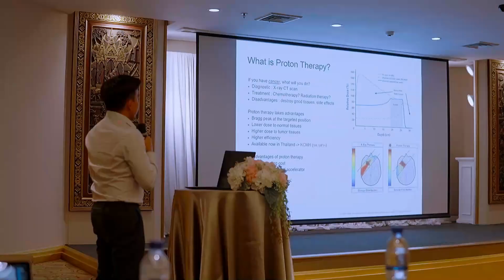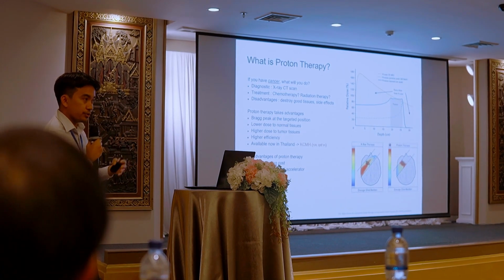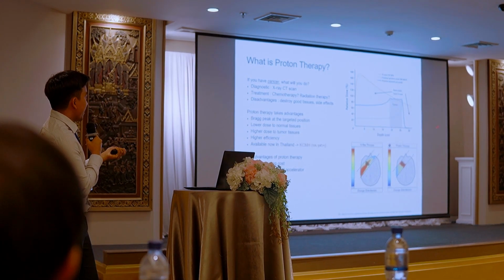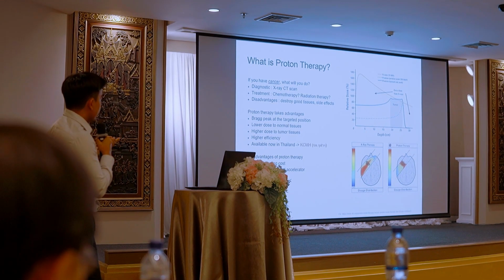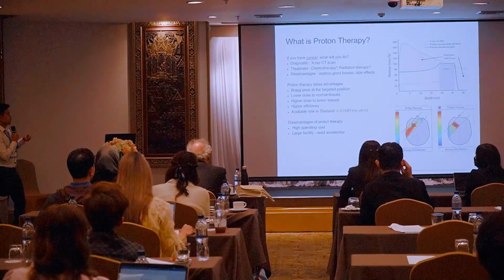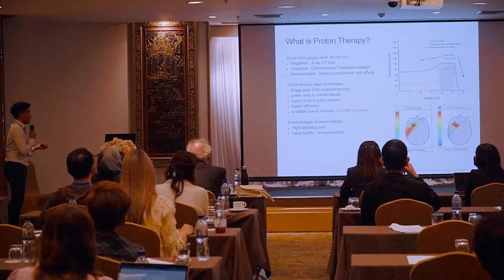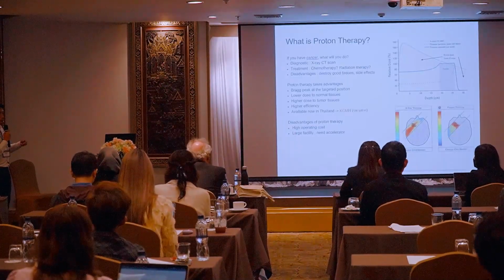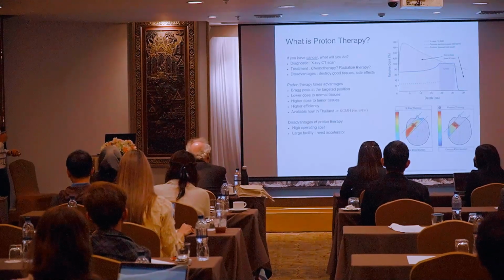And then I think, okay, this is the disadvantage of the operation, chemotherapy and radiotherapy, right? Proton therapy has an advantage because you do not need to open your skull. You just shoot the proton into the patient's head and let the proton deposit energy there. Another advantage is that the proton delivers a lower dose to normal tissue and a higher dose directly to the tumor tissue. And luckily, it is now available at KCMH. There are also some disadvantages of proton therapy, because it has a high operating cost. You need an accelerator, you need technicians to run the accelerator, and you need a large space for the facilities compared to radiotherapy or chemotherapy.